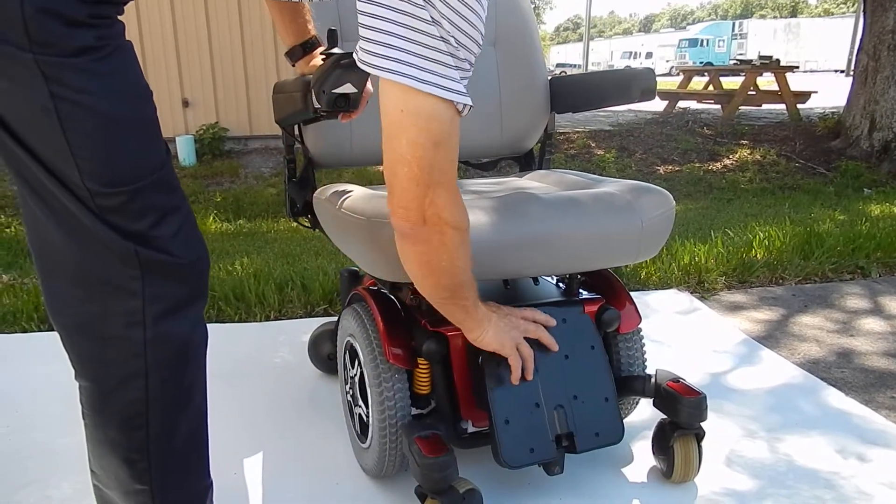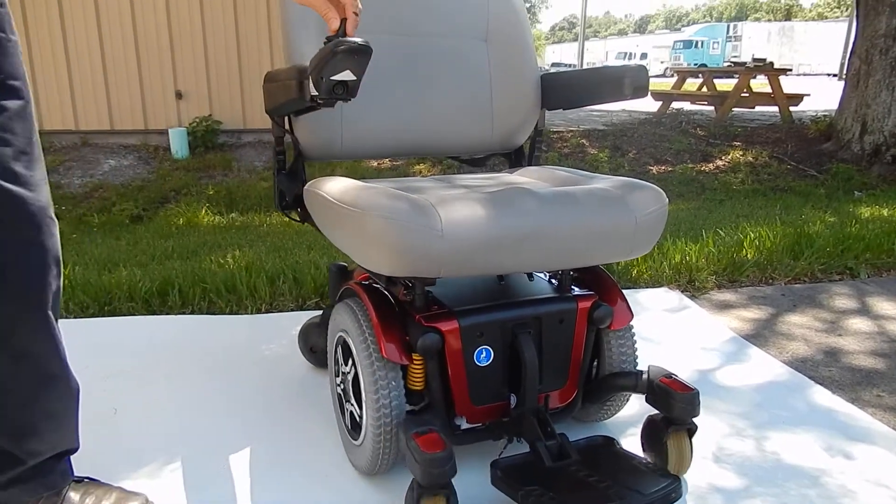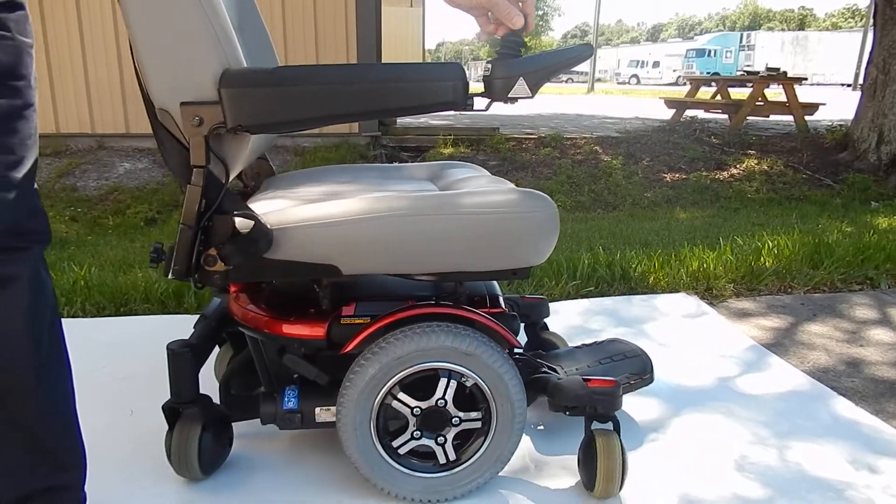The footplate is also flippable to get in and out. This has a great suspension. Fantastic chair.